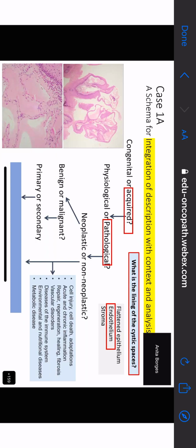You think it's neoplastic. So why was Sweta saying non-neoplastic, just because she wants to be contrary? The question is, how do we know? We now know that this is endothelium, and what kind of endothelium is it likely to be? It is not full of blood, is it? No. So this has got a serous secretion in it, serous material, and therefore it's very likely to be lymphatic. Now, can you get dilated lymphatics anywhere in a space? Yes, you can.